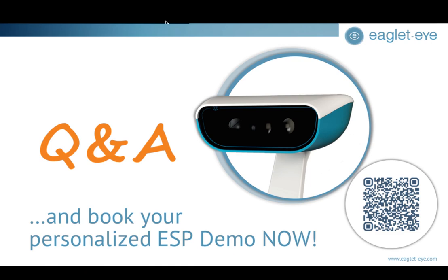What is the first point, or the height, that you're going to actually have the plastic come into contact with first? That's where elevation is in many ways more useful if you're thinking what kind of data map to use, and that's across all topographers for contact lens design. It's actually the elevation that we're really looking at to figure out what the best shape of lens that we want to use should be.